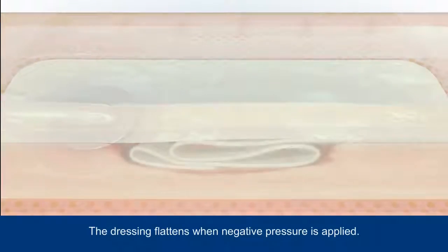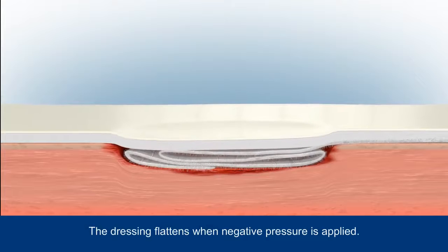When negative pressure is applied, air is sucked out of the dressing, causing it to flatten.